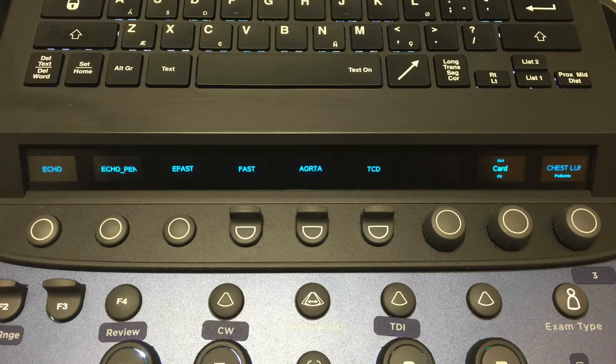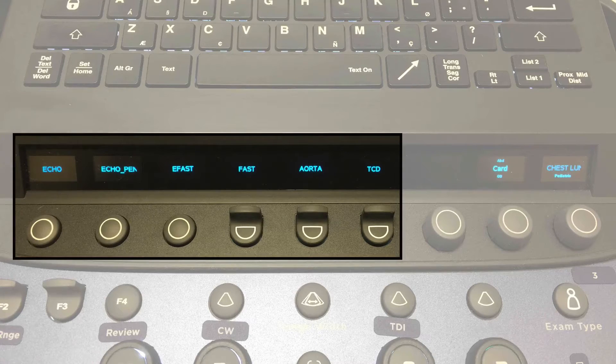You may notice that several presets — such as the E-FAST, the FAST, and the aorta — are all abdominal presets. However, when you select the preset by name, it also tags the exam type for the worksheet and QPATH. I encourage you to use the soft key for the appropriate study you are doing so that it saves you time on the back end.